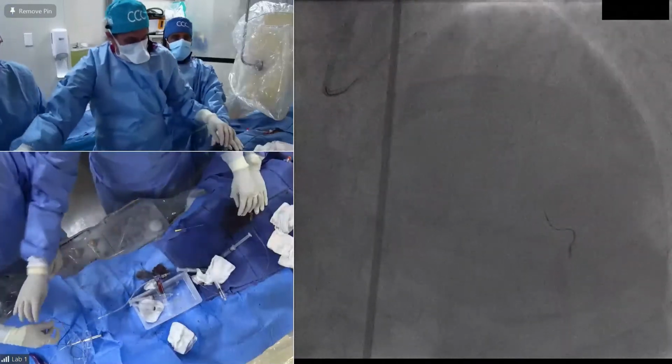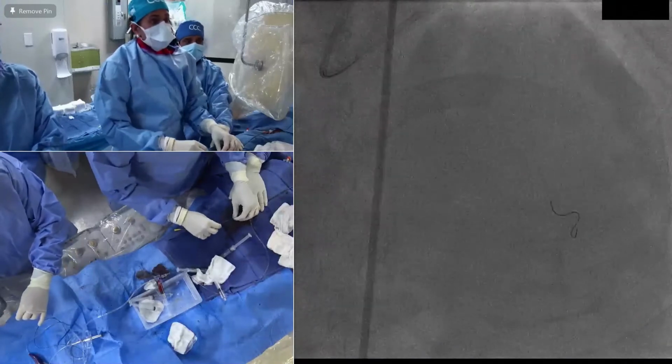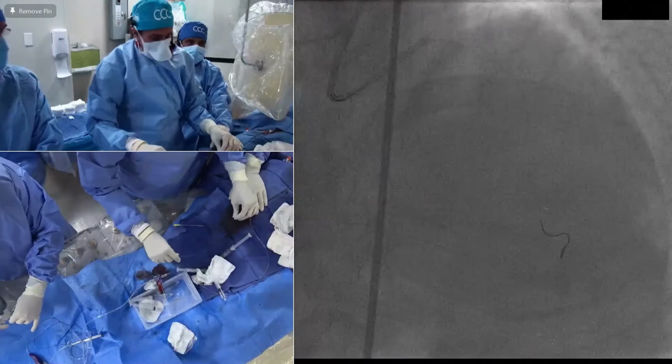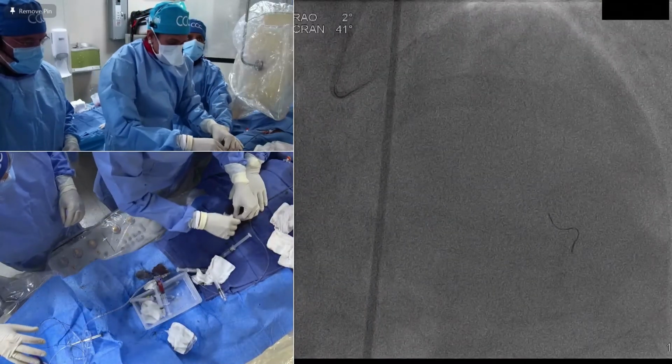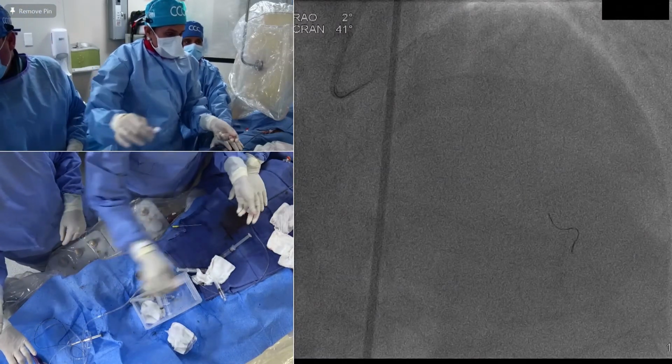Dr. Puskas, I know we're going to have a discussion of indications and revascularization guidelines. The presentation of this case was quick, and I may have missed it, but am I correct in understanding this is an otherwise healthy 67-year-old gentleman with 3-vessel disease and diabetes?